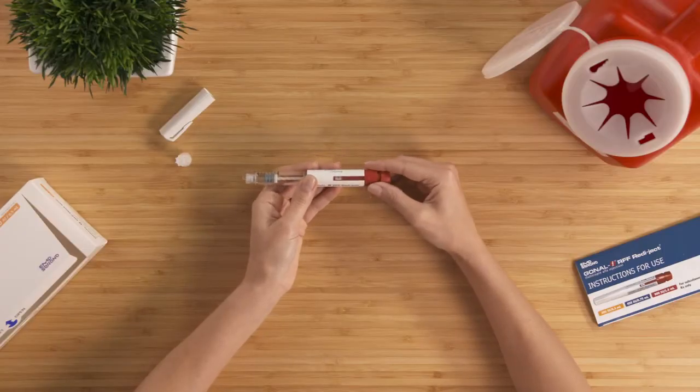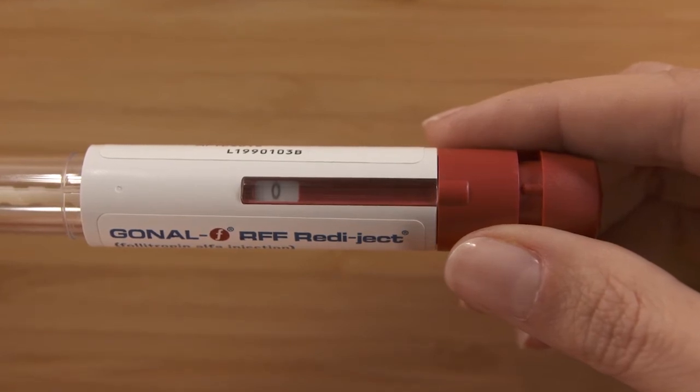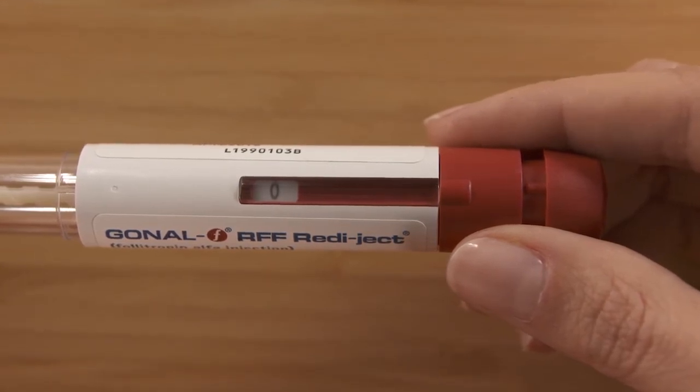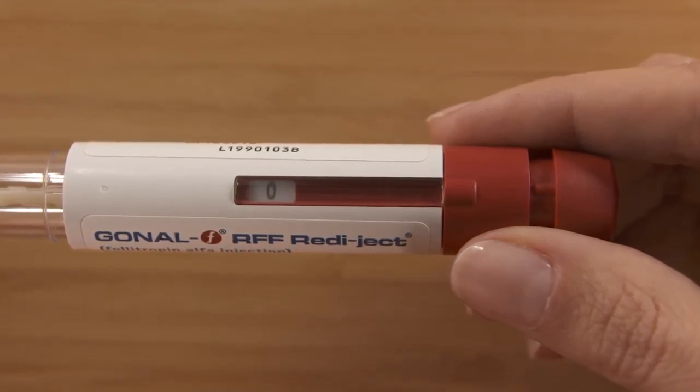Let's see how we did. See how it reads zero? We've completed the dose. If for any reason your pen does not show zero, you will need to use a second pen to inject the number shown in the dose information display to complete your dose.